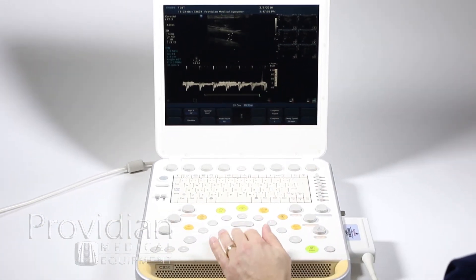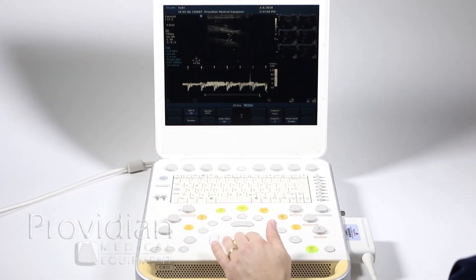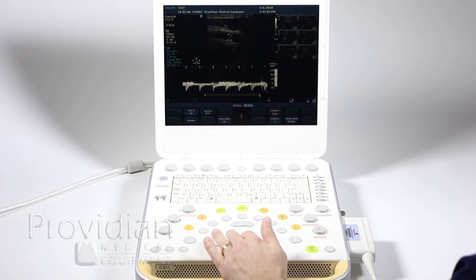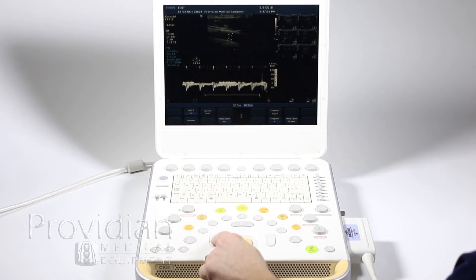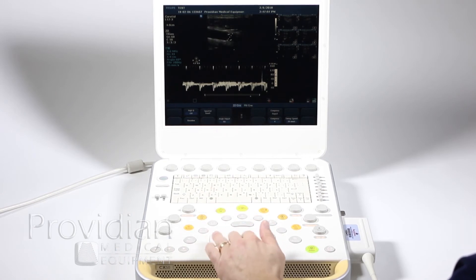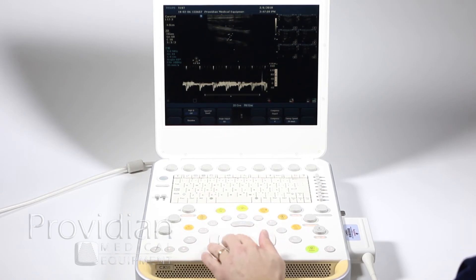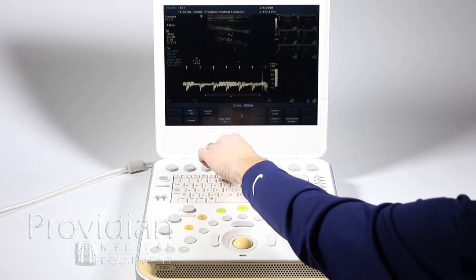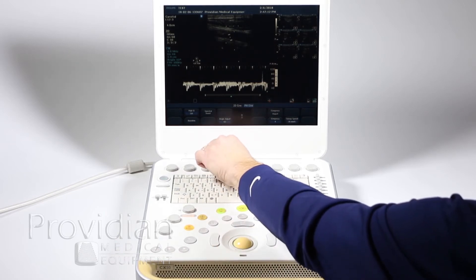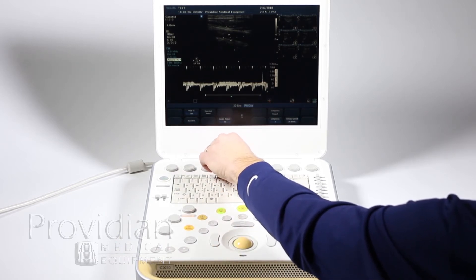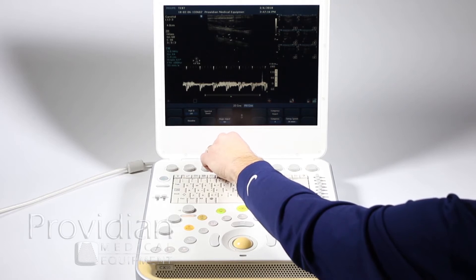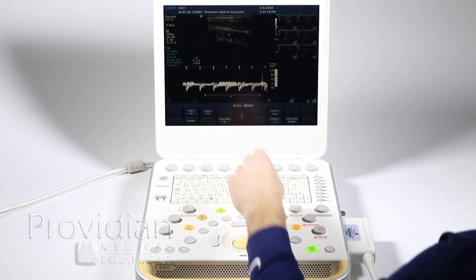Here I can scroll through the cine with the trackball. I can hit this and go look through my 2D cine — that's how you're going to flip back and forth. I can make my angle adjustments here.